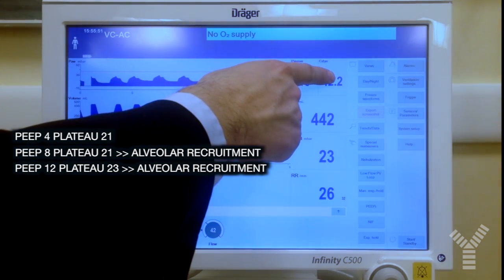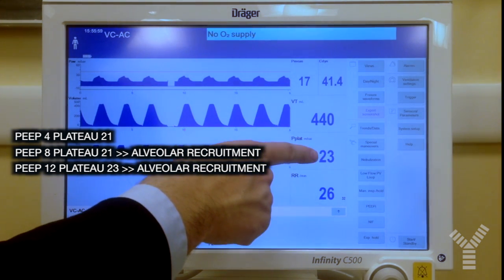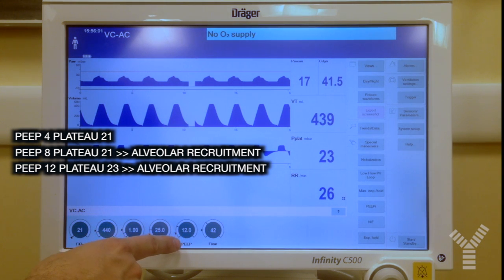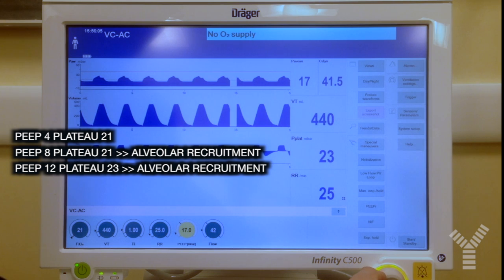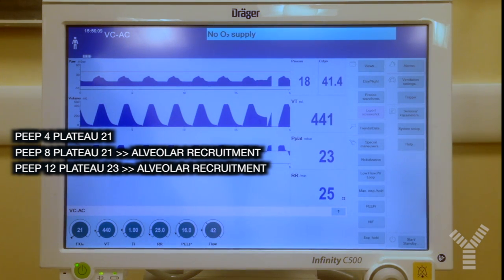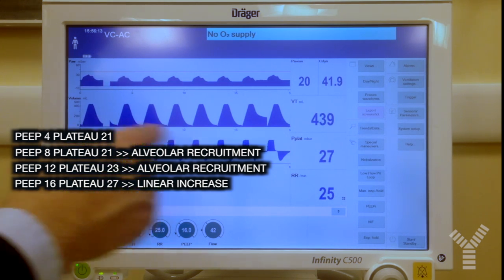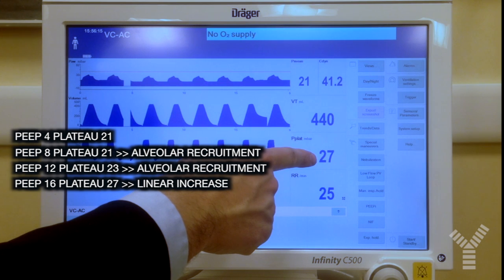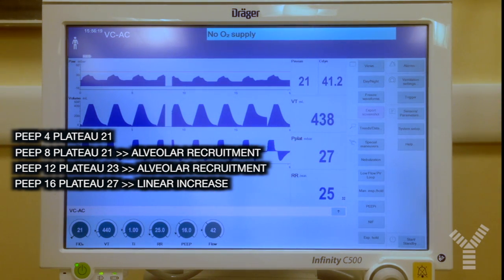Dynamic compliance has also increased, which likely indicates some alveolar recruitment. If we increase PEEP further, let's say to 16 cmH₂O, plateau pressure increases by the same amount — about 4 cmH₂O — and this indicates that we are in the linear portion of the pressure-volume curve.